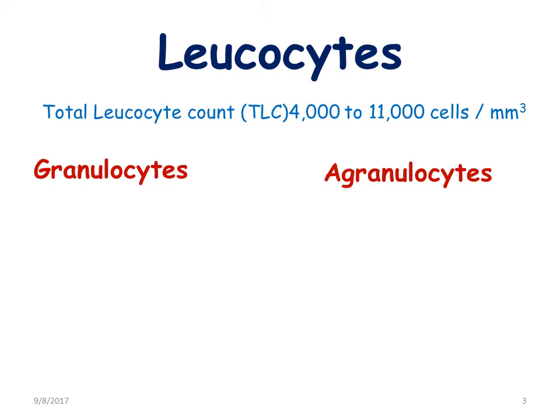Basophils will be identified by the purple to dark blue nucleus and dark purple to black large granules, while the lymphocytes will be identified by a dark purple nucleus and sky blue cytoplasm, and the platelets will normally appear violet to purple violet.